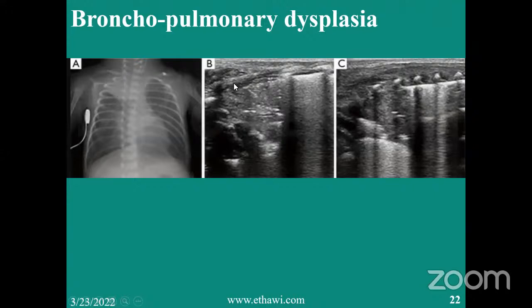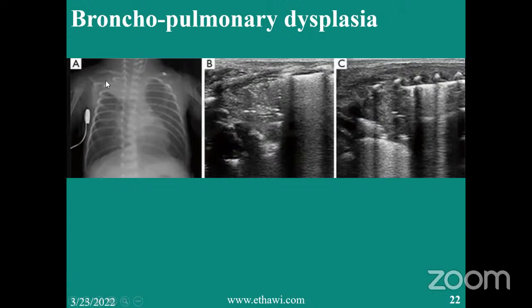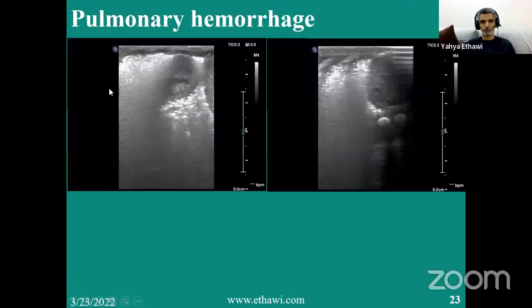No, this is an example. I didn't show you the 12 zones of the lung ultrasound. Here you'll see a global view, and here you are seeing a local view. So yes, possibly there is collapse, and you'll see it very obviously on the lung ultrasound. It's very easy to see that you're losing the lung architecture.